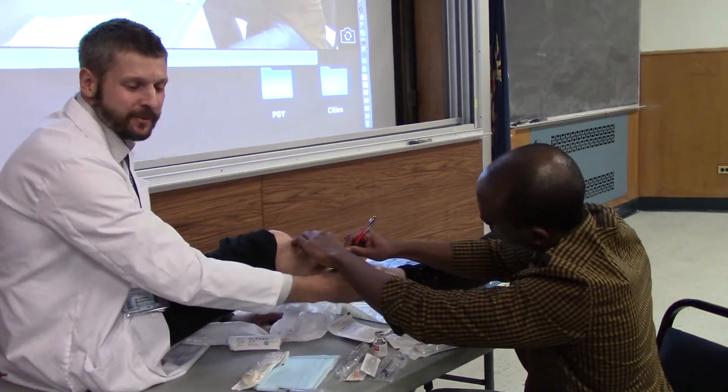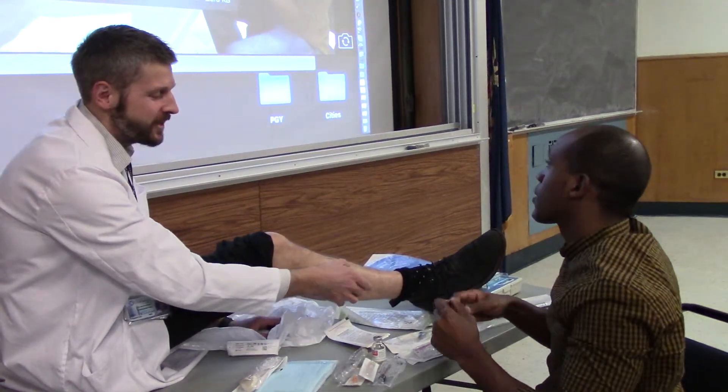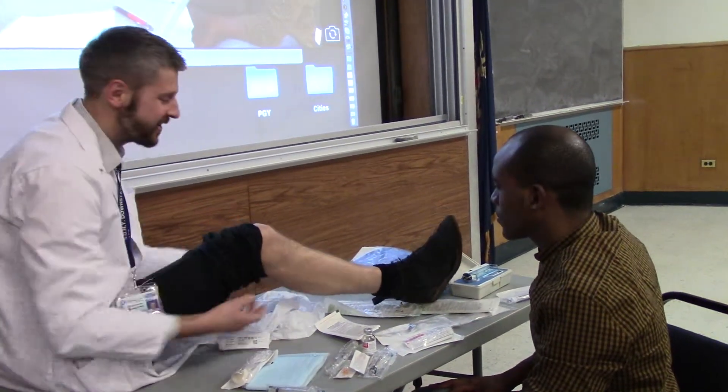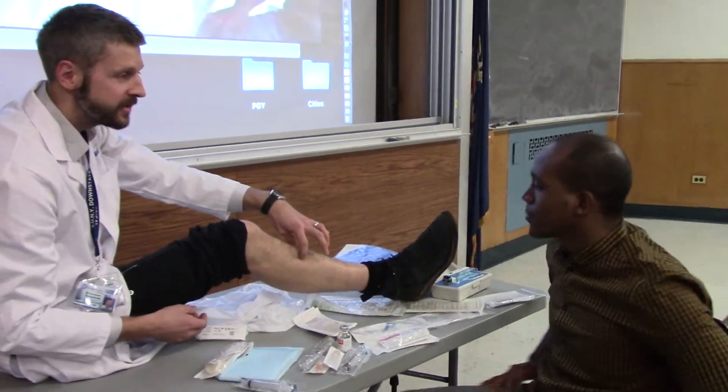If we had damage there, such as a snowboarding injury, then classically it would be — what was the function in that compartment? Can you do dorsiflexion in this area? And posterior would be more plantar flexion. So we're just trying to isolate those muscles to figure out where the compartment is.